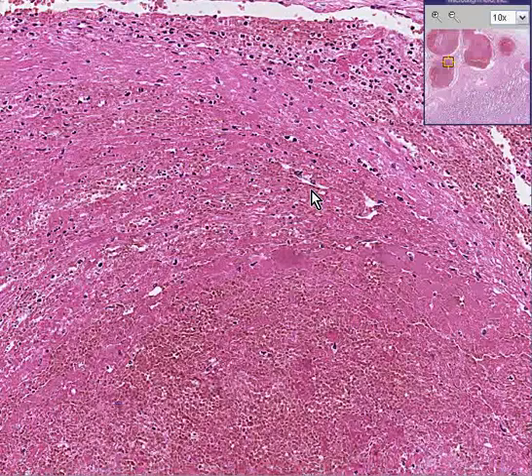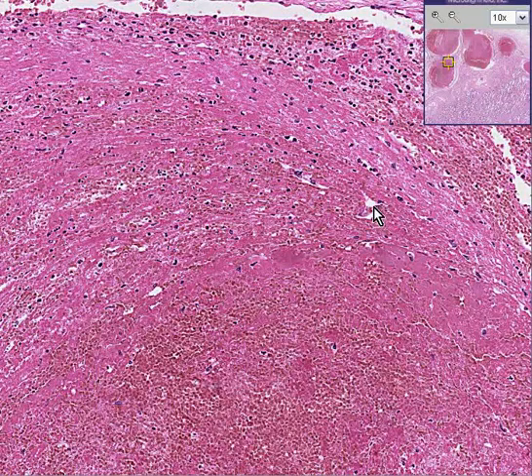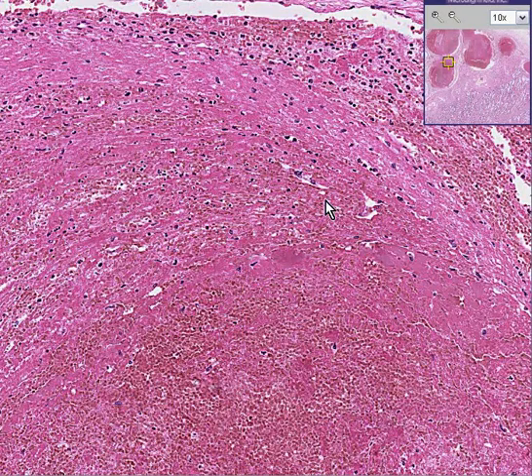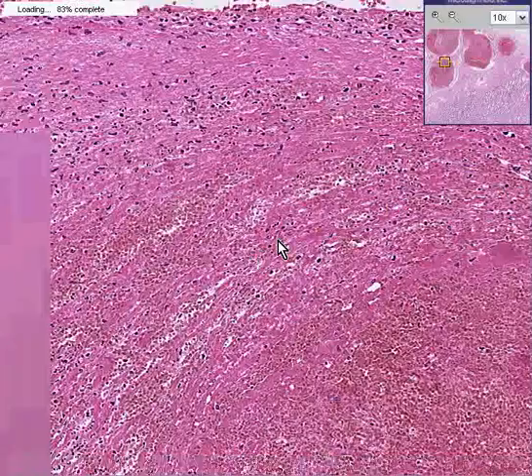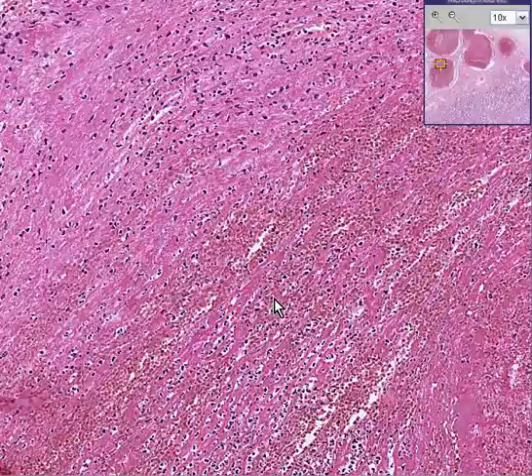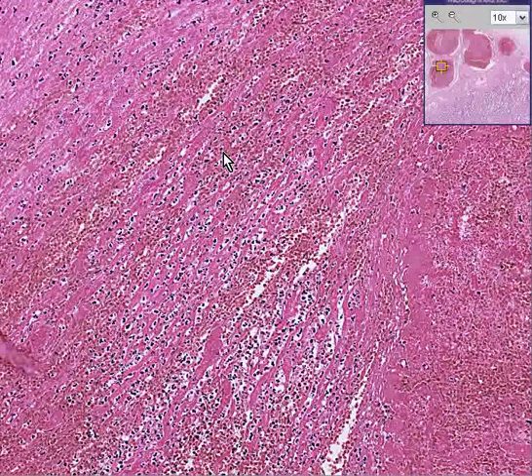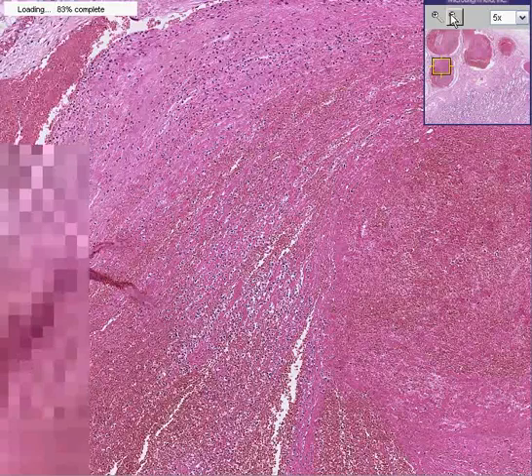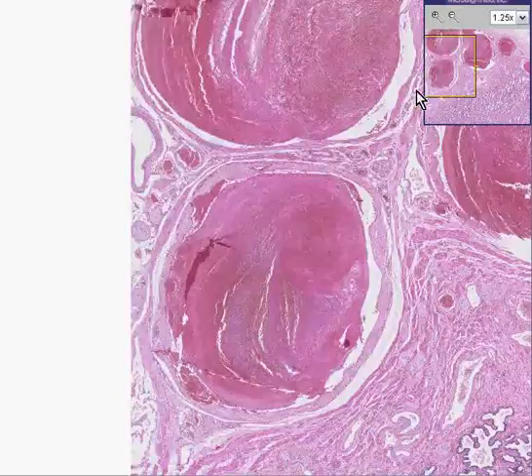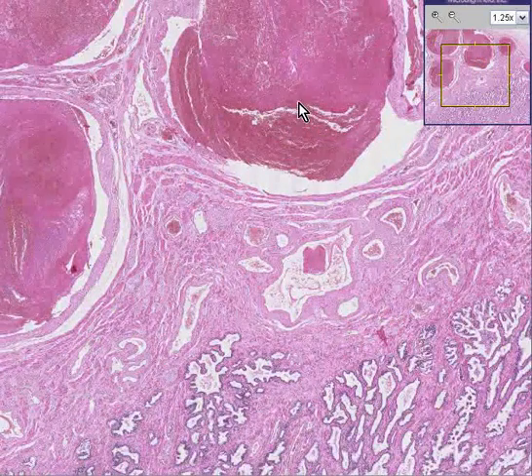I think you might recognize that perhaps here and here and here, and maybe here, we have some vascular spaces, some ingrowth of capillaries, which makes this organizing. Technically speaking, what we really have here — all I really want to say — is we have organizing thrombi within a prostate, in the veins of the periprostatic venous plexus.